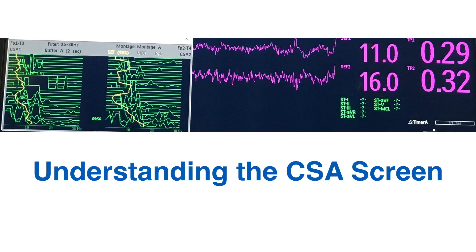Now I want to talk about how to interpret the CSA screen. On the screen you can see the typical CSA output. In purple, you have the raw EEG — EEG1 at the top looking at the left side of the brain, and EEG2 below it looking at the right side. Odd numbers always refer to the left side; even numbers to the right. EEG1 is the raw, real-time, uncompressed EEG between the left-sided electrodes; EEG2 is the right-sided equivalent.